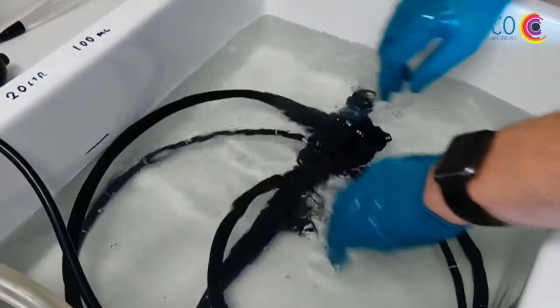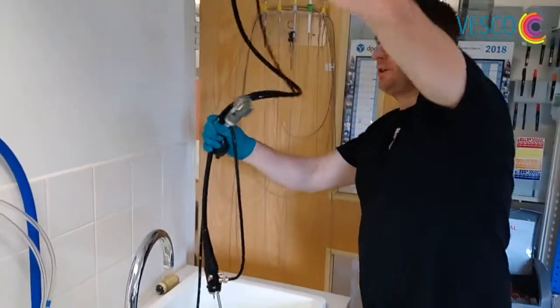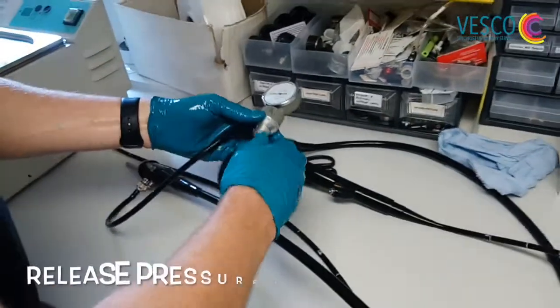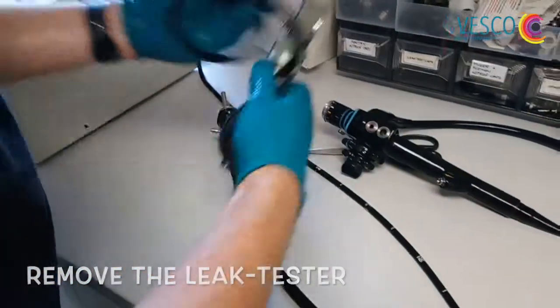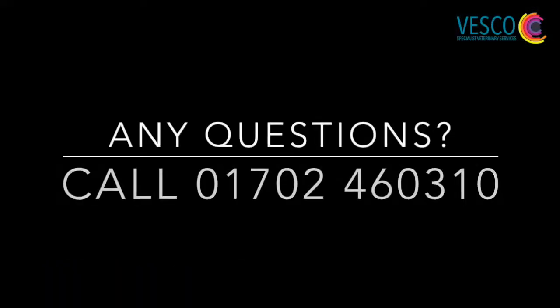Once we've completed the check, I take the scope out of the sink, support it and hold it up, and just let the water drain back out nicely into the sink. I'm going to take it to the desk, release the pressure, and remove the leak tester. Then I'm going to dry the scope.